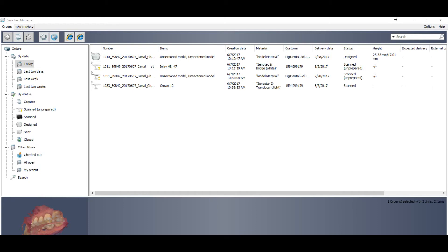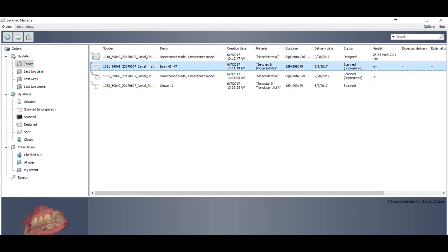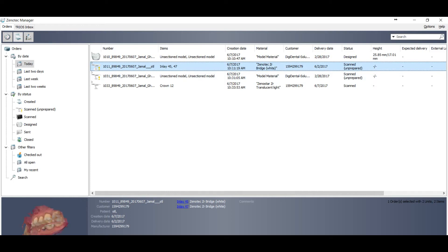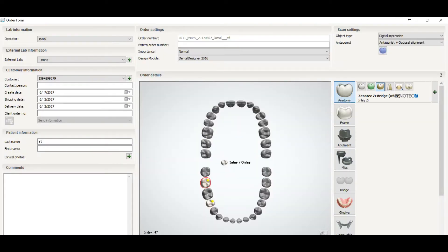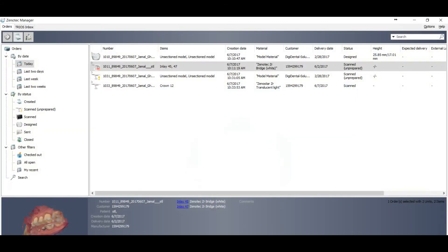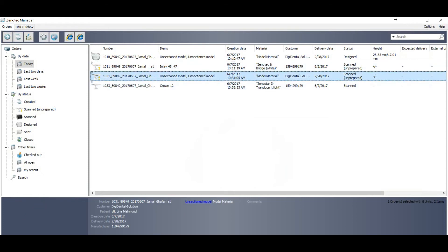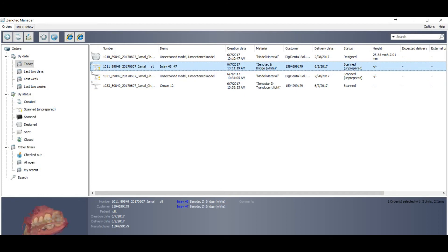Now let's talk about the other method. The doctor has selected the order as some restoration — for example, inlay or onlay. How can we convert these types of files into STL? You can see the order has a yellow mark. The order before we converted also had a yellow mark. A yellow mark means you have to process the order before you can convert it.